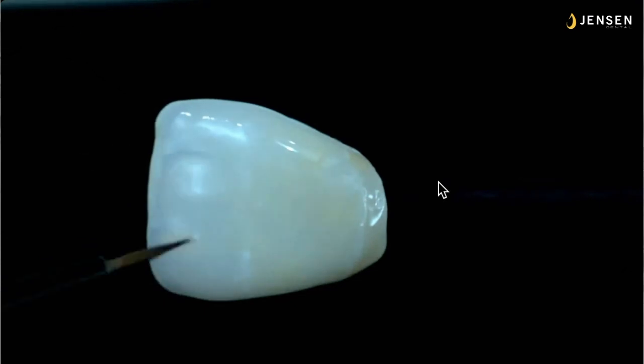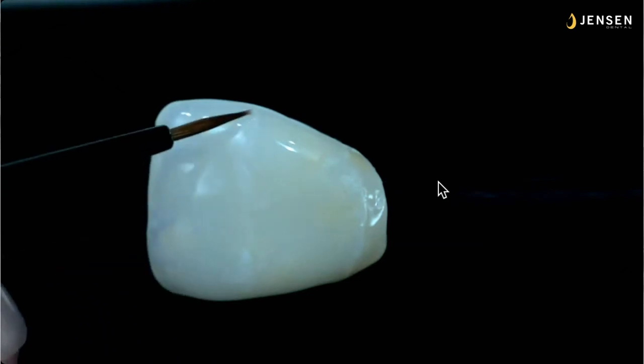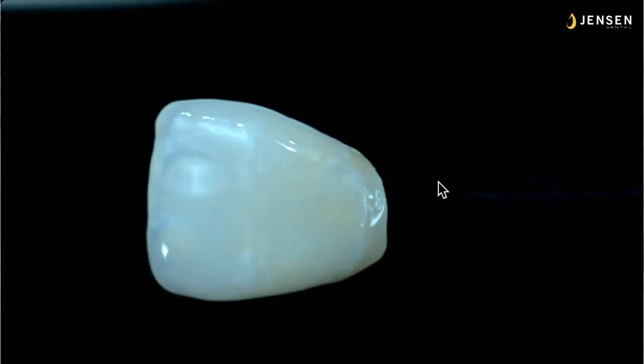Never use snow straight. Snow straight you can see for miles. It's very, very bright, very opaque. So we're just trying for a little bit of a subtle effect right here.